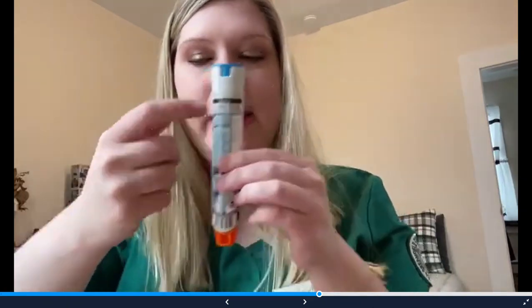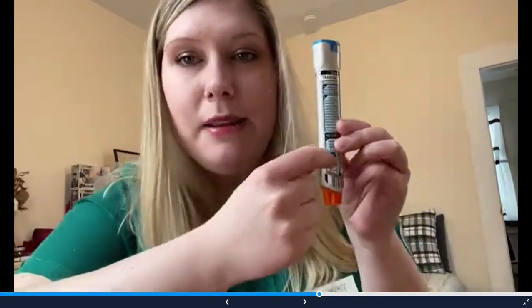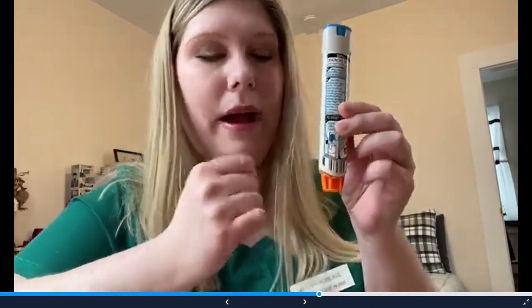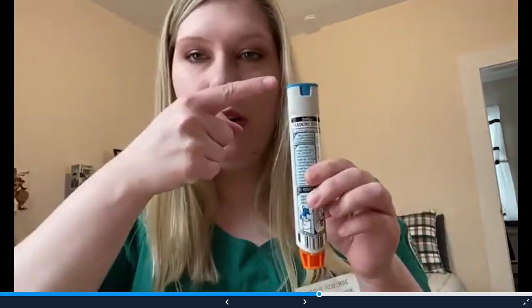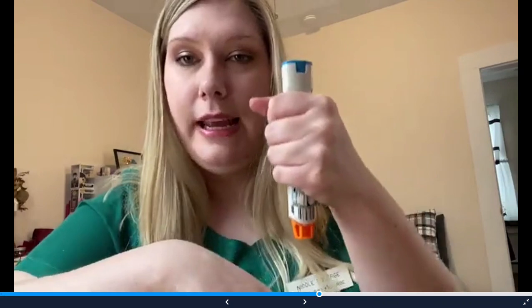Now, for severe allergic reactions called anaphylaxis, you are going to use the medicine epinephrine. So epinephrine usually comes in an EpiPen auto-injector. Some of you might already know what this is and some may not. So inside of this is the medicine epinephrine. It's gonna come out inside of a needle. Remember, when holding one of these, you never wanna hold the top and you never wanna hold it at the bottom. Always hold it in the middle.